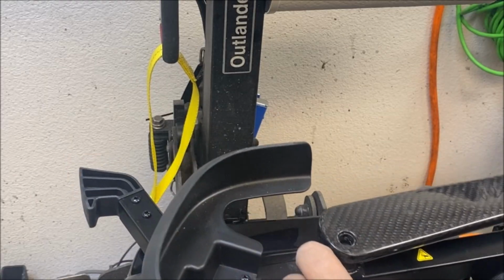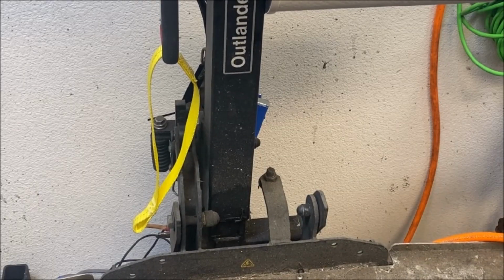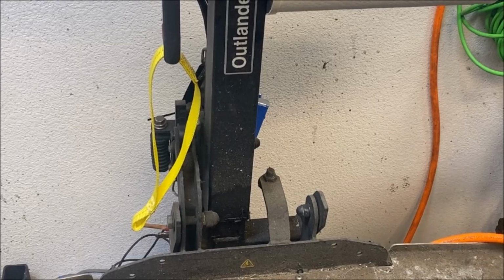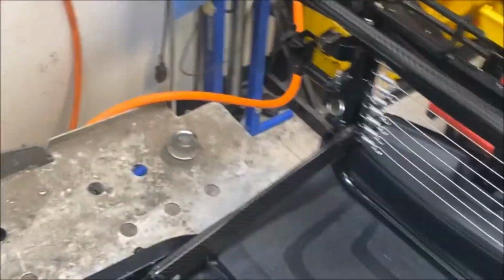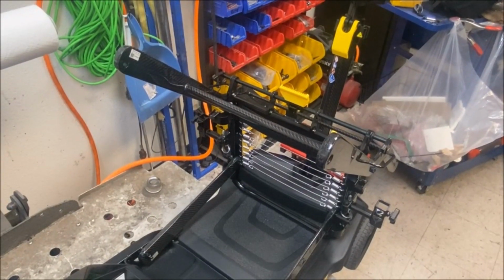Alright, now I've got to get that right back down. Bring the tiller back up. Okay, yeah, there's a same affair on the seat portion of it. There, the 10 mil bolted through and through there. I don't think you're going to see much.